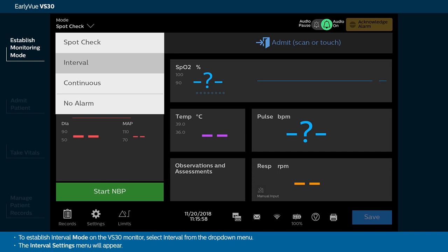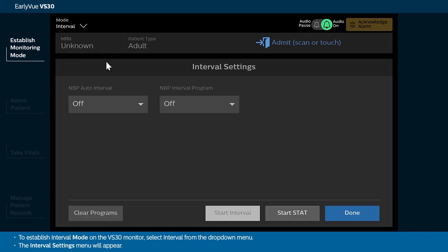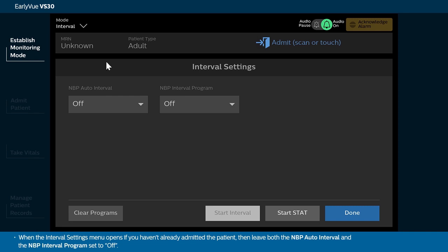To establish interval mode on the VS-30 monitor, select Interval from the drop-down menu. The Interval Settings menu will appear. When the Interval Settings menu opens, if you haven't already admitted the patient, then leave both the NBP Auto Interval and the NBP Interval program set to Off.